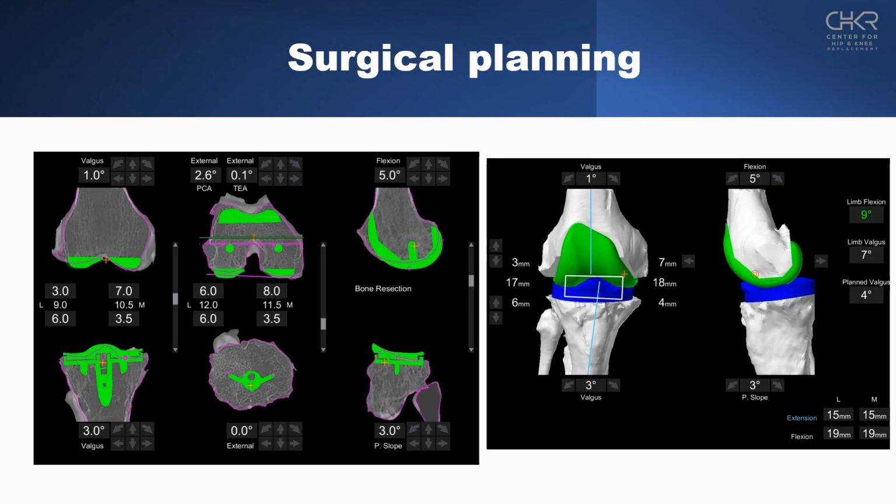However, with robotics, we can make very subtle, precise changes that are specific to the patient's anatomy. So traditional conventional, we would accept the 0 degree mechanical alignment from the prior slide, but with robotic surgical planning, we can assess the deformity, and this patient has a flexion contracture with a valgus deformity. So instead of taking a mechanical alignment cut and then doing secondary releases to the posterior lateral capsule, as well as the iliotibial band, we can make subtle changes on the femoral and tibial side so that those soft tissue releases won't be necessary in order to achieve symmetric gaps.